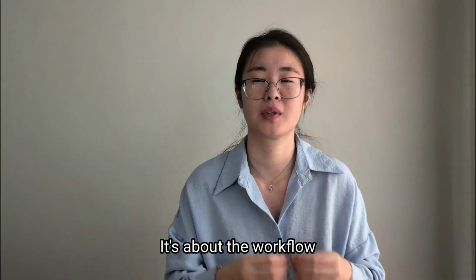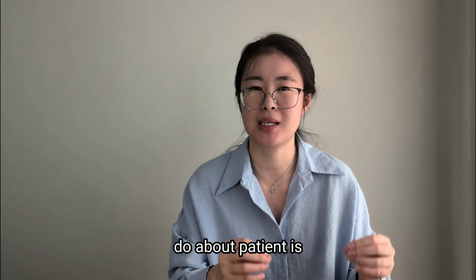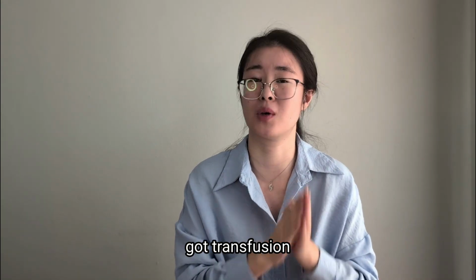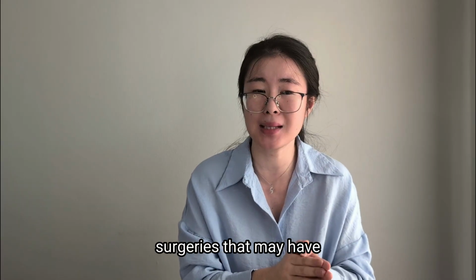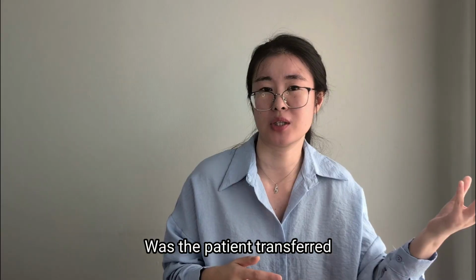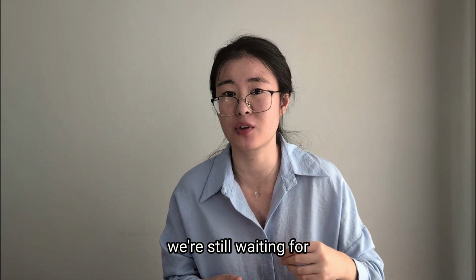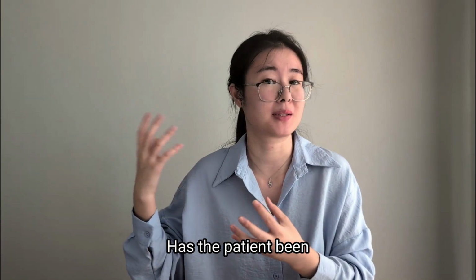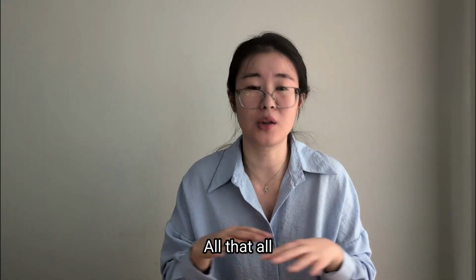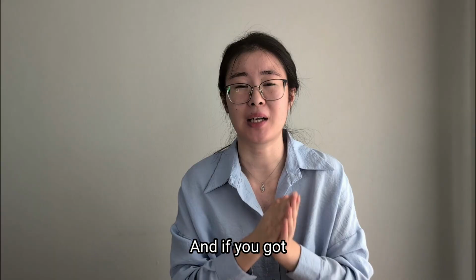And that leads us to the next thing I want to talk about: the workflow. At this bench, one of the biggest things we need to do about the patient is confirm the medical history. Has the patient ever had a transfusion? Were there any major surgeries that may have involved a transfusion while the patient was unconscious? Was that on the chart? Was the patient transferred from a different facility that may not have finished the charting, or are we still waiting for some more information? Has the patient been on the floor for not long enough that the previous shift hasn't finished the charting? Sometimes we'll be making phone calls to the floor.